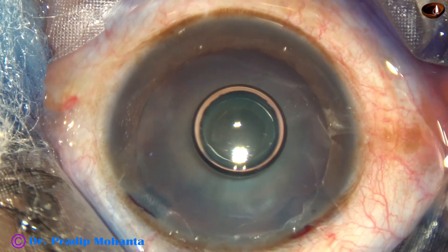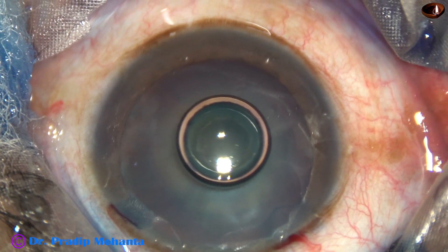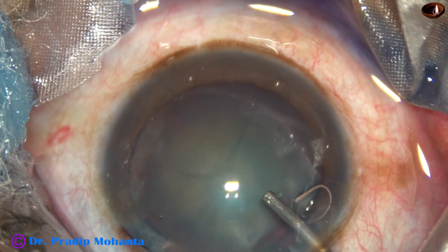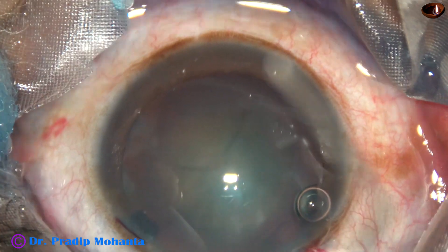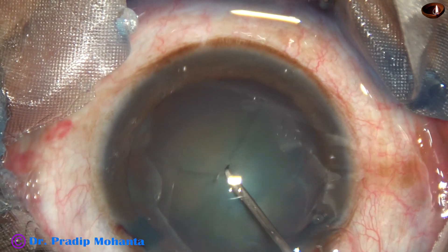And now, 2% hydroxypropylmethylcellulose is injected into the anterior chamber. This is a very good, very affordable viscoelastic substance that we use in India.